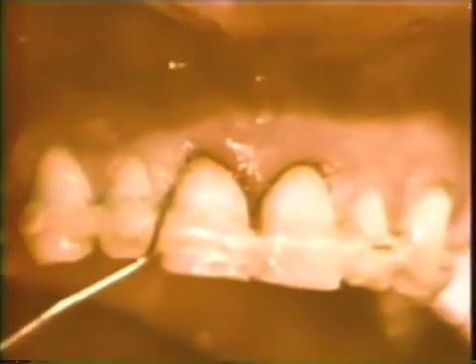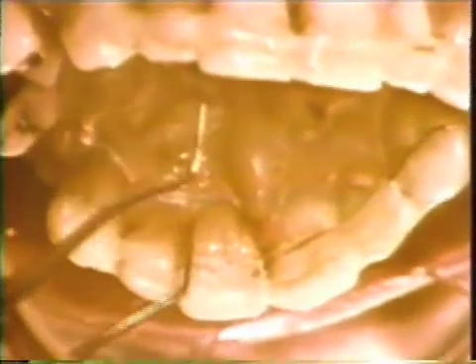The lesion on the mesial side of the maxillary central incisor is explored with a calibrated probe. It is obvious that the defect on the right extends more apically than that on the left. The sulci in adjacent areas measure three to four millimeters in depth. The palatal infrabony pocket on the mesial aspect of the central incisor measures eight millimeters. It is important to note the palatal gingival groove on the maxillary right central incisor. This groove probably played a primary role in the etiology of this infrabony pocket. The probe follows the groove into the defect.